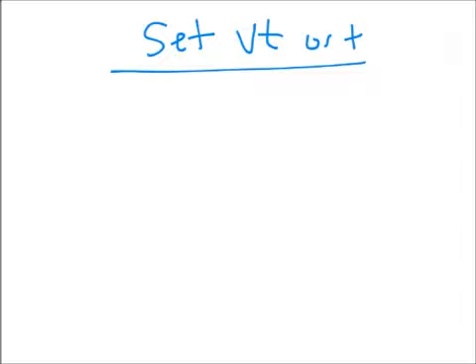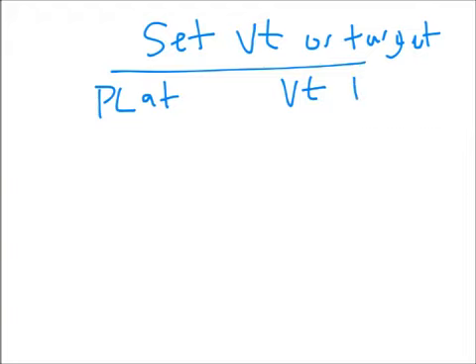Another way we can use plateau pressure is actually in setting tidal volume. So if I want to set or target a tidal volume using pressure control ventilation, I can use plateau pressure as a guideline. And I presented this in a previous video, my tidal volume video. So I have measured plateau pressures, and then my target tidal volume. And a target tidal volume should always be based on ideal body weight.